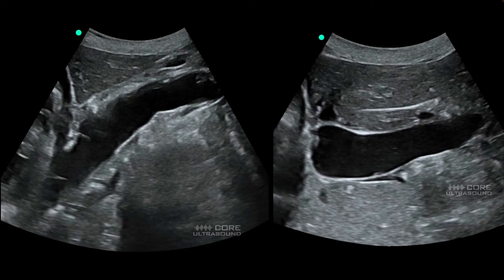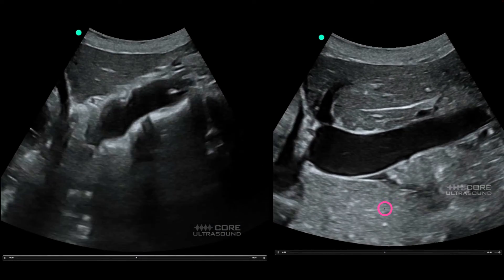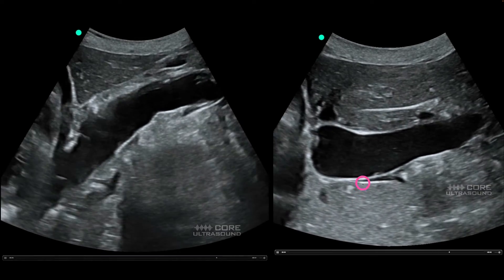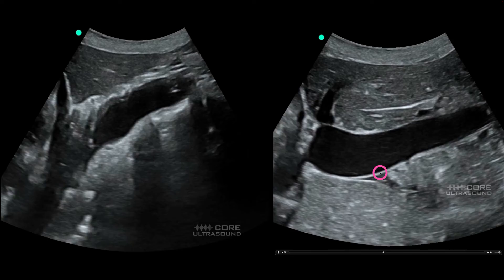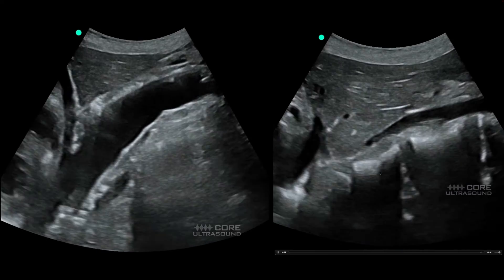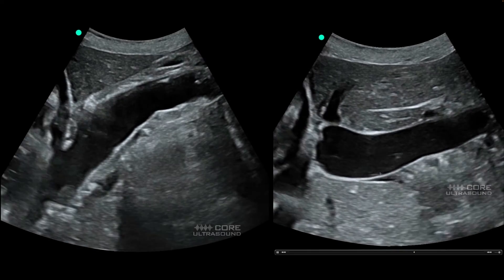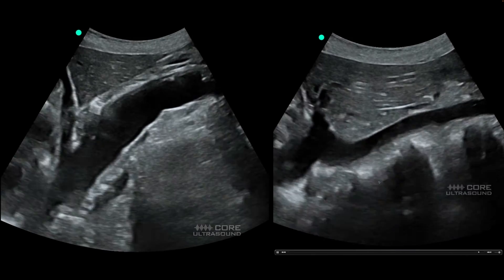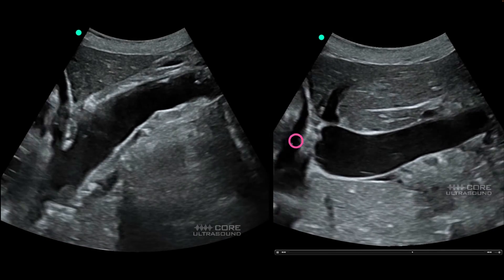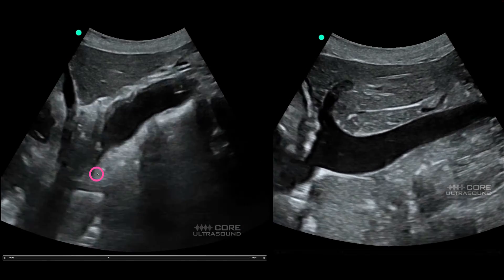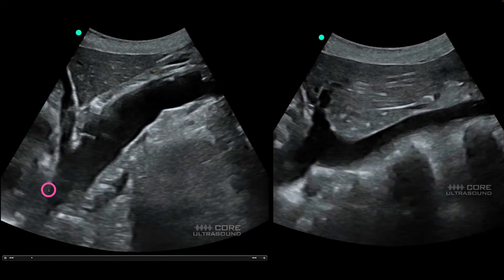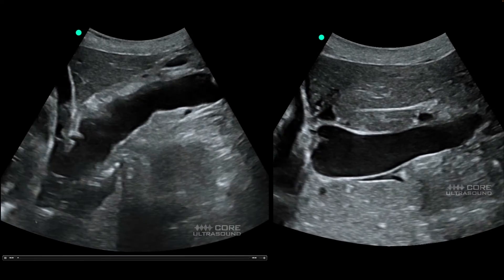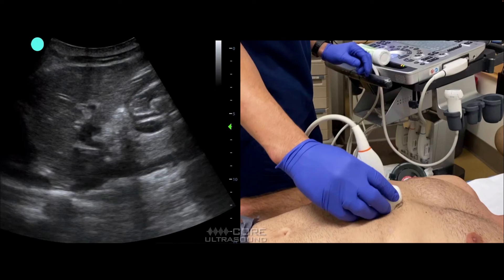One common error is getting confused between the aorta and the IVC. Typically the aorta has thicker walls and is more pulsatile, but the IVC can also appear hyperechoic and will pulsate due to central venous pulsations. What I do is look at the vessel's direction: the IVC is more horizontal and goes directly into the heart, whereas the aorta is more vertical or oblique and its vector goes behind the heart, ultimately landing in the left ventricle.